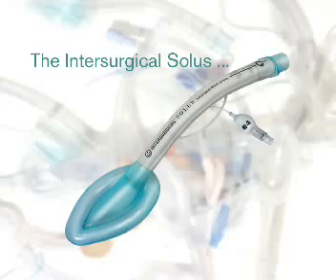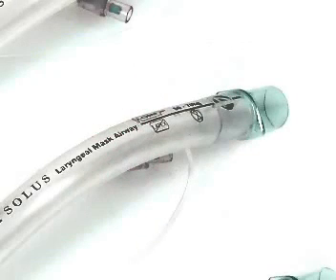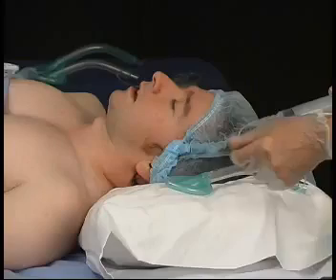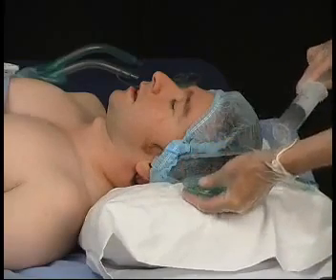What we're about to demonstrate is the correct insertion technique for the Intersurgical Solus laryngeal mask airway. Firstly, it is important that you select the correct size for each patient, and the patient weight does appear on the airway tube. Next, prepare the laryngeal mask airway by fully deflating it to a very tight vacuum.